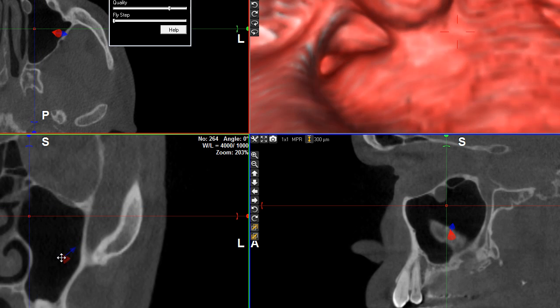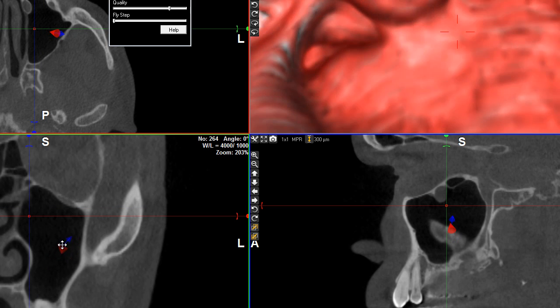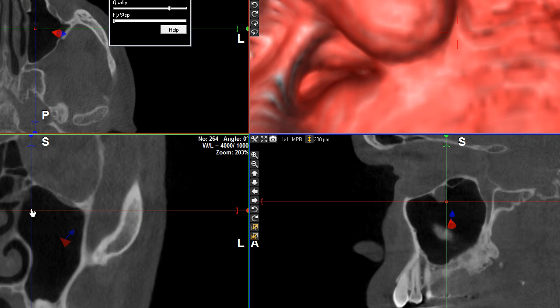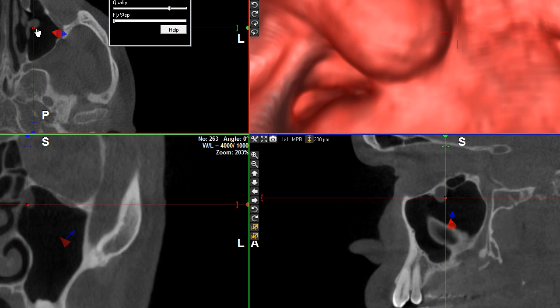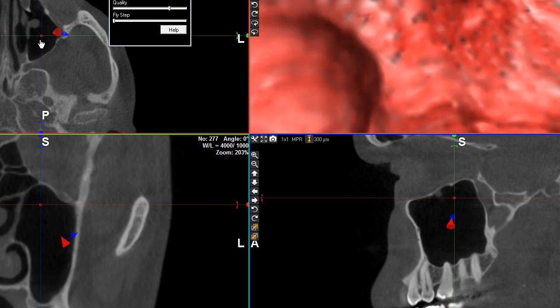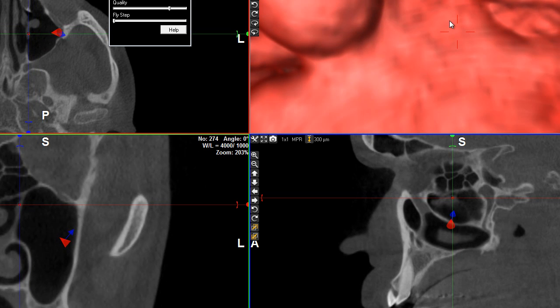In general, at the start, I would recommend to simply point it out, because if you draw a virtual line between the cone and the point, you simply know exactly what you're looking at. You are seeing here the ostium, which would be the entrance of the sinus — quite useful indeed just to be checking exactly the 3D anatomy that you want to see within its context.